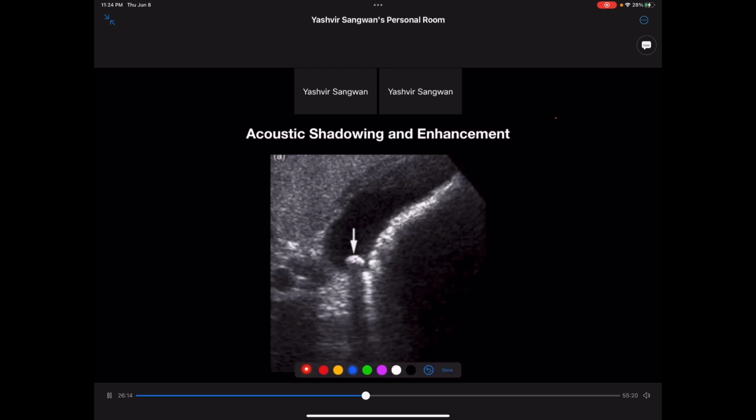Okay. So now let's see an ultrasound image to see how it really works in real life. Okay, so you have piezoelectric crystals lined up. This is obviously a linear kind of image. The liver is made up of homogeneous tissue, so at a constant rate there is reflection from different areas, and here you have a homogeneous gray. What is happening here? The liver tissue reflects some, and then the gallbladder comes and boom, all sound just travels through, no reflection, so it is dark.